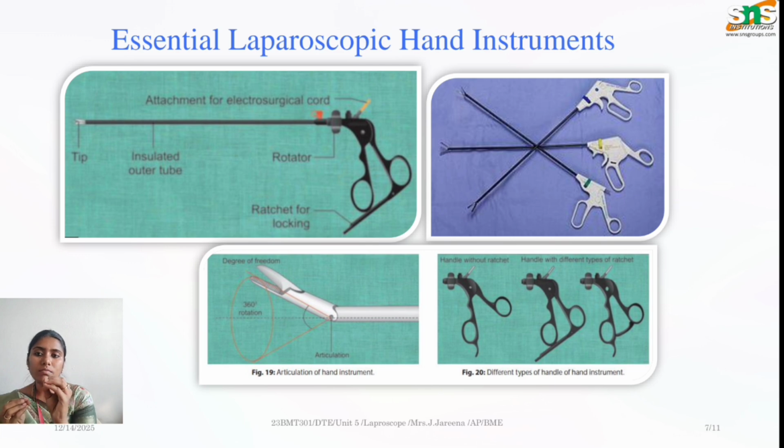And the tip has articulation of a full 360-degree rotation. It has the property to rotate through all 360-degree angles, so that we can have proper navigation, proper guidance, and easy access to the targeted area. And on the other side, in the fourth picture, I have given the different handles of this instrument. Based on comfort, surgeons can go with different types of these.